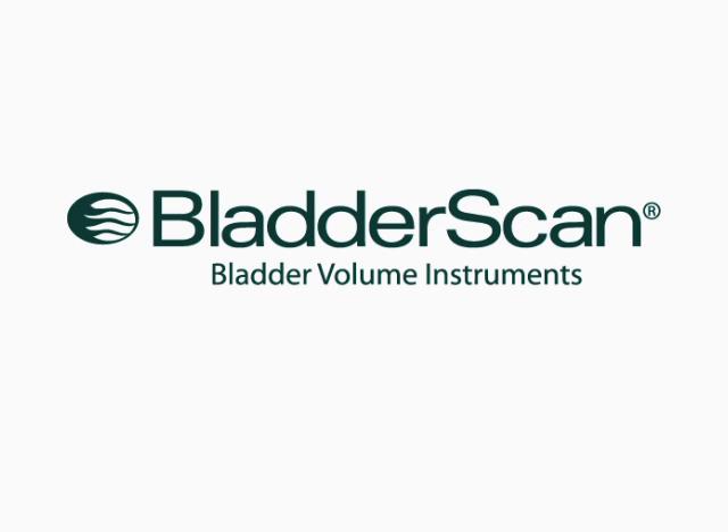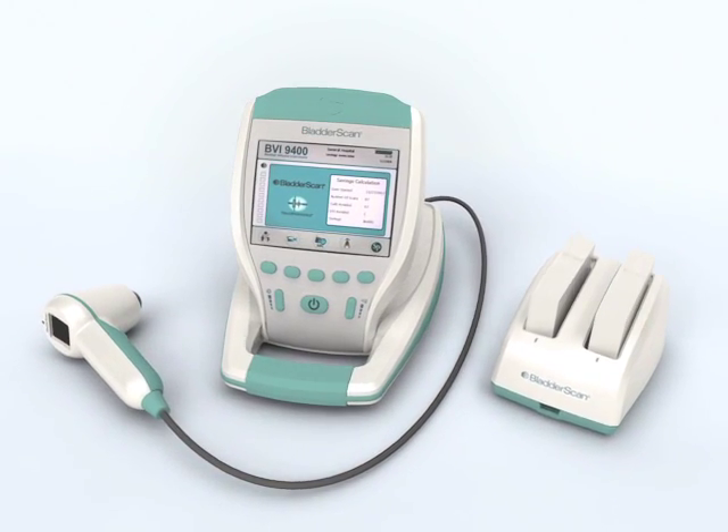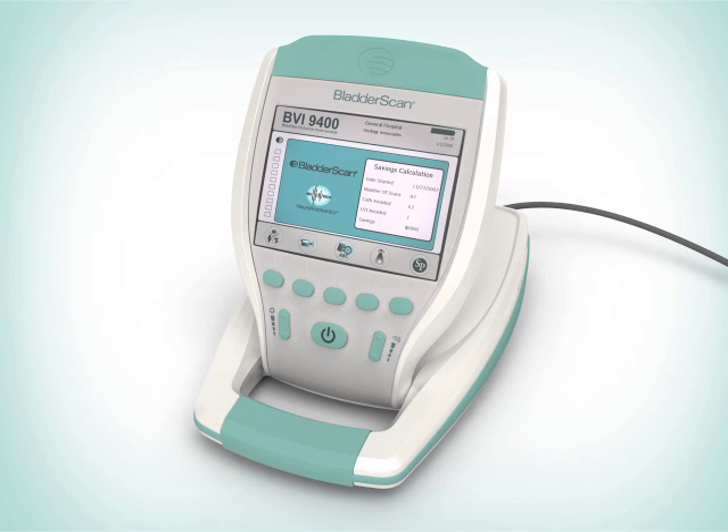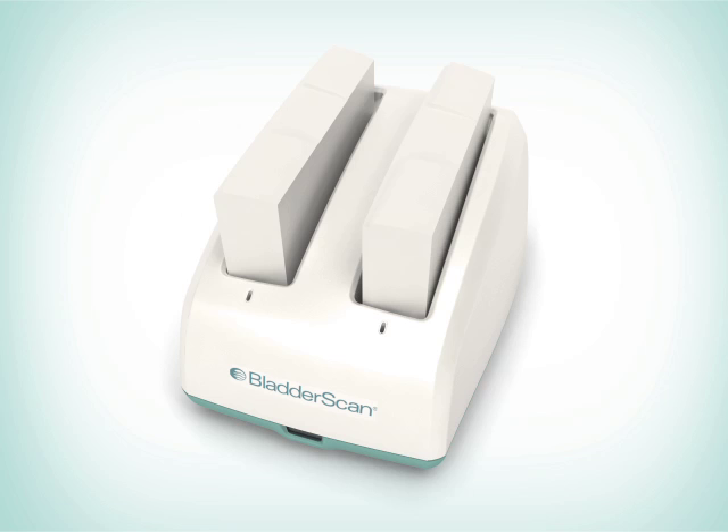Introducing the BladderScan BVI9400 Bladder Volume Instrument with Neural Harmonics Technology. The BVI9400 consists of a battery-operated color display console, an ultrasound probe that scans the patient's bladder, and a combination battery charger and wireless hub.